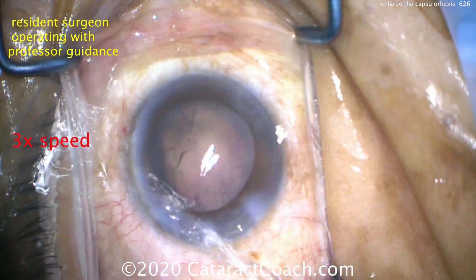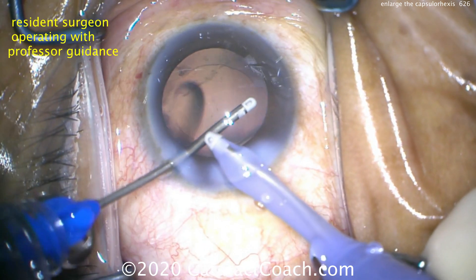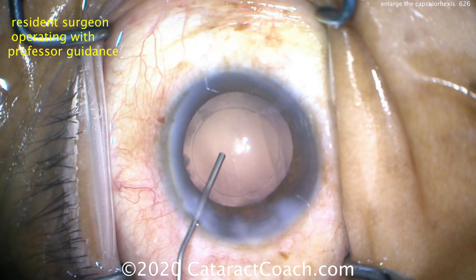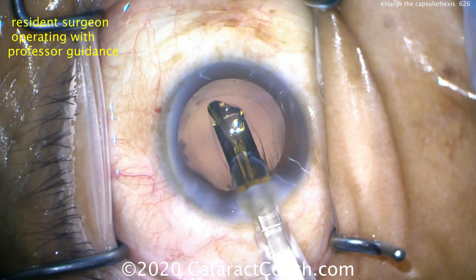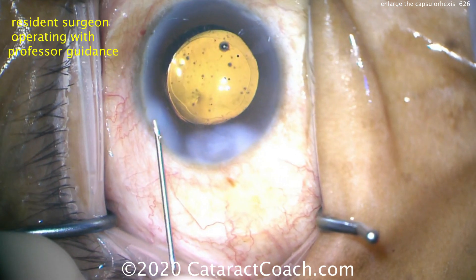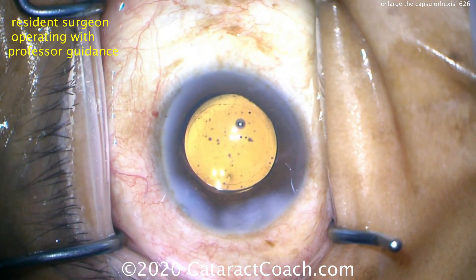Here's a beautiful 5mm rexis, and that looks great. Finishing up the case — a little bimanual irrigation aspiration to remove the lens cortex, polish up that lens capsule. This resident did a beautiful job. Filling the capsular bag now with cohesive viscoelastic. Here comes a single-piece acrylic lens going into the capsular bag. The way we enlarged that rexis kept it strong — there is no weak point. That's a beautiful overlap: 6mm optic, 5mm rexis. That looks beautiful.